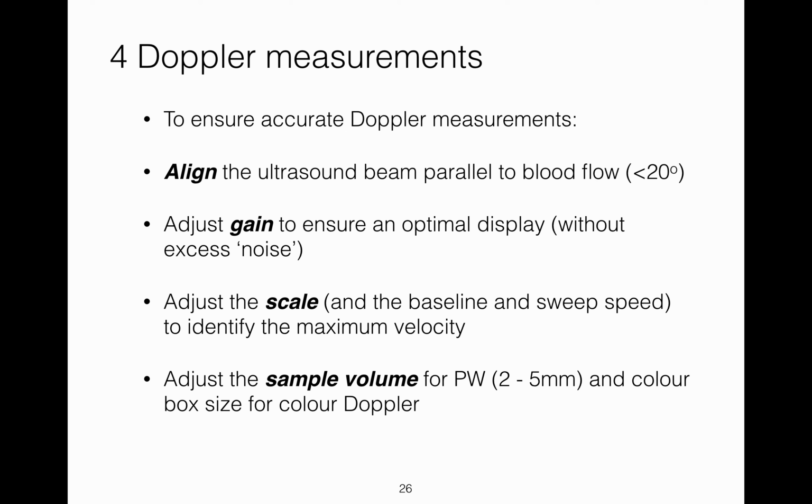Doppler measurements. Doppler echocardiography measures blood flow and tissue movement in the heart and great vessels. Doppler has replaced many invasive cardiac procedures for measuring hemodynamics because, if done well, Doppler measurements can be very accurate. As mentioned in the previous lecture, Doppler imaging has strengths and weaknesses, which a sonographer must be aware of in order to optimize the strengths and minimize the weaknesses.